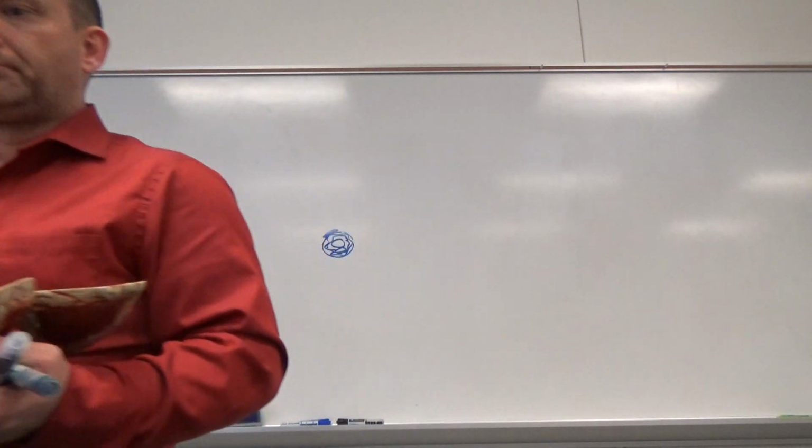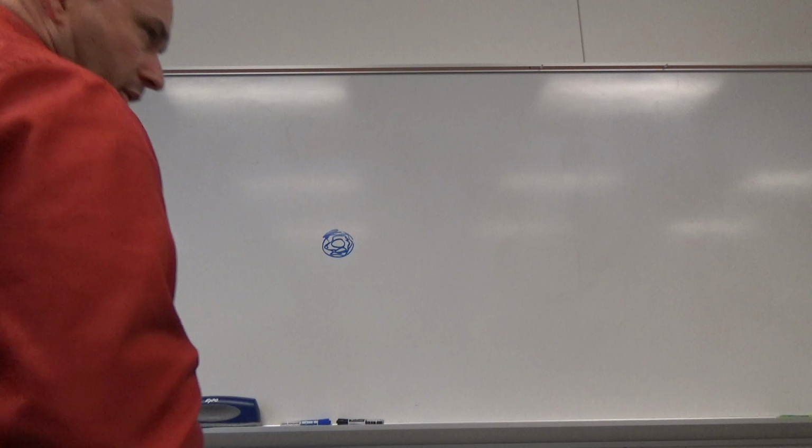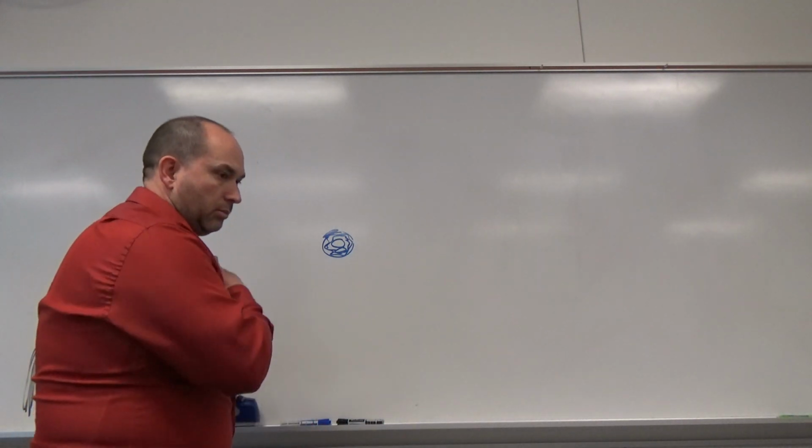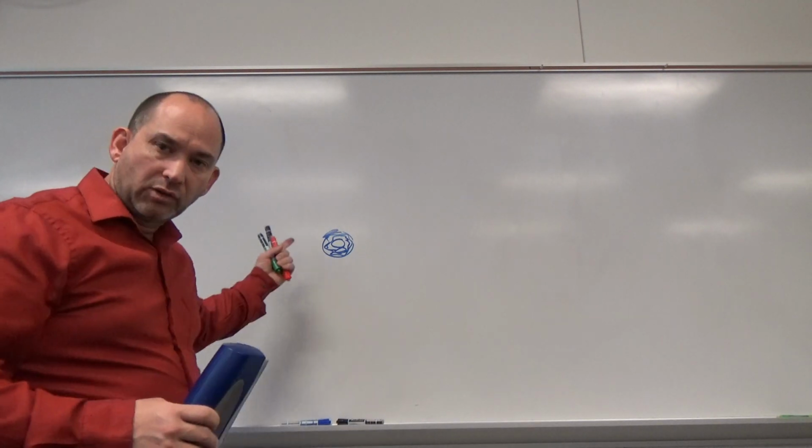And then I slide down even further to be right over top of the LV apex, so that I just have that little bit of residual volume left in the apex area. Indicator in that is going to be pointing more towards the left shoulder of the patient. So that's all we need, is a 2D clip of that.